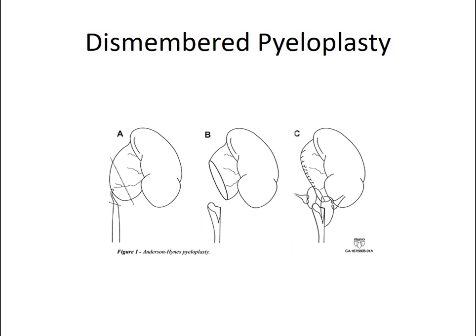So you can see we are cutting across the pelvis of the kidney as well as the ureter and sewing it together. That anastomosis is not watertight upon completion typically. And so a catheter prevents back pressure, which would increase leakage.